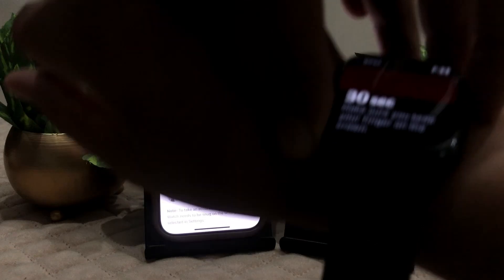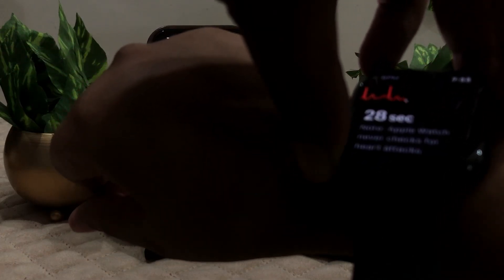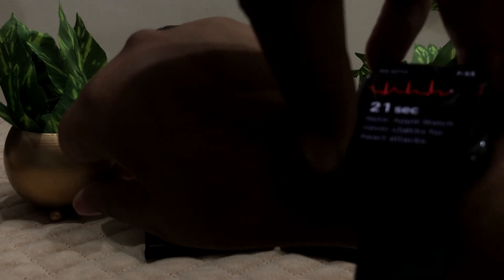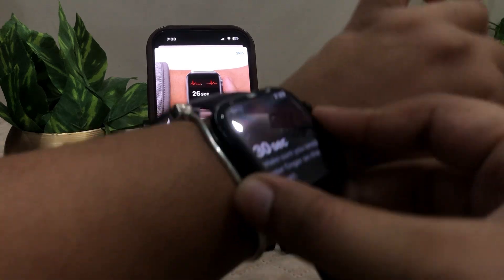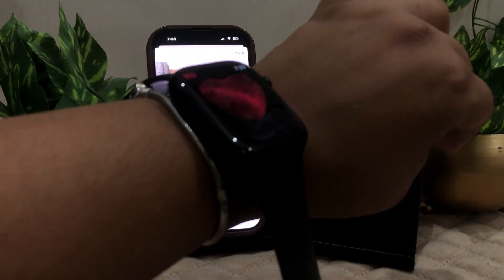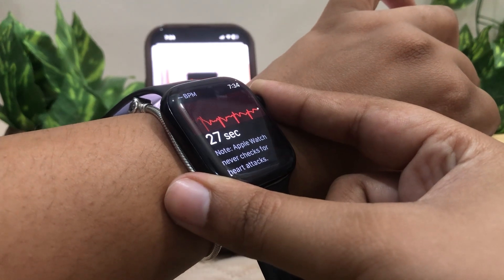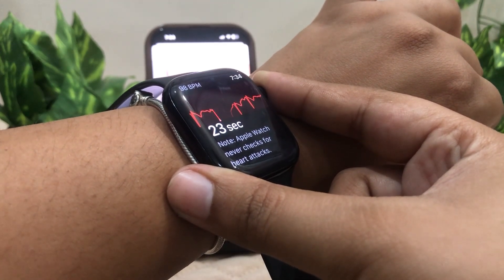Hold your finger on the crown like this. It will take 30 seconds. Hold your hands still — let me just place it here to make it more clear. Hold your finger on the crown like this. Note that Apple Watch never checks for heart attacks, so make sure to consult a doctor for that.